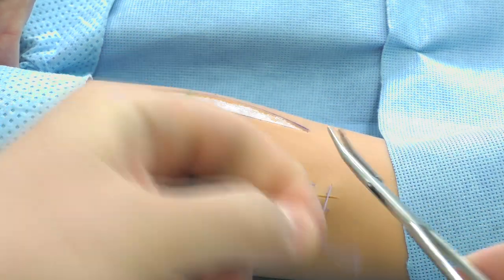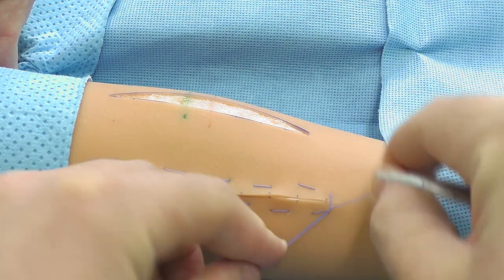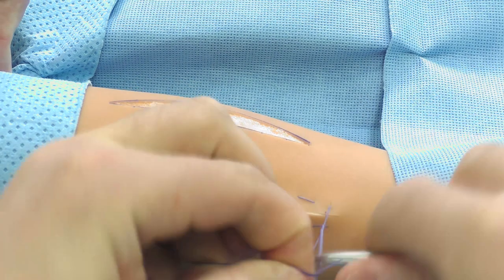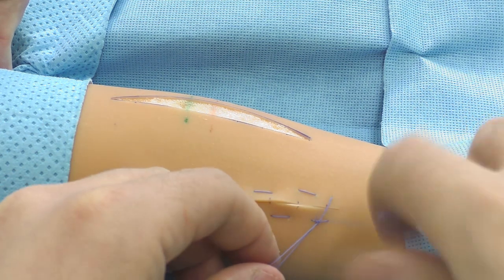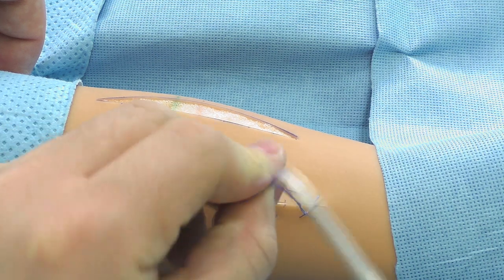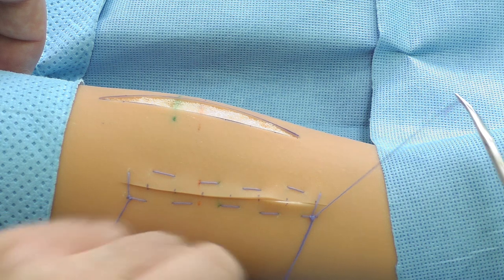While drawing the ends, a loose stitch is pressed and then a knot is being made in an unusual way. At the final stage, the free filament ends of the first and last knots are cut off according to the rules.